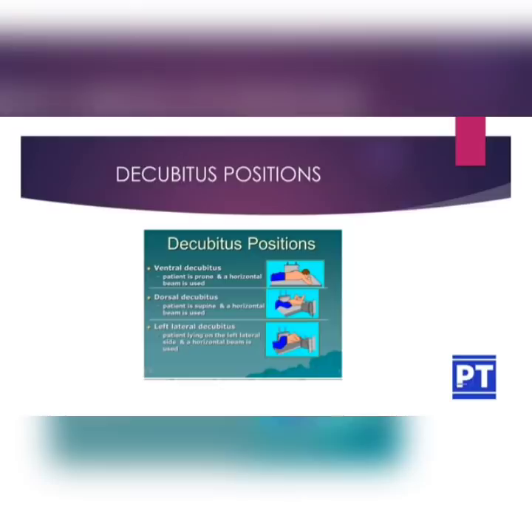And this is the left lateral decubitus. The patient is lying on the left lateral side. When the patient is turned to either side, then it is known as lateral position. If the patient is turned to the patient's left side, then it is known as left lateral, and when the patient is turned to the right side, then it is known as right lateral. And here we are using a horizontal beam for exposing the patient, and it is known as left lateral decubitus.